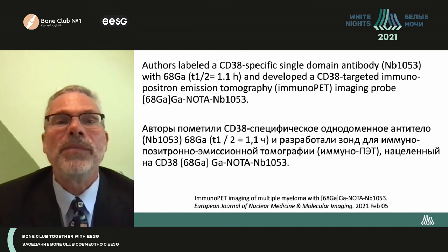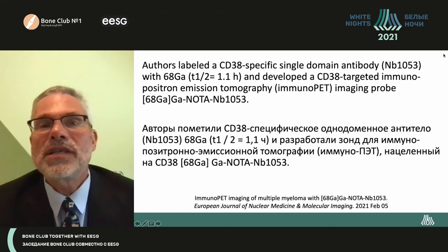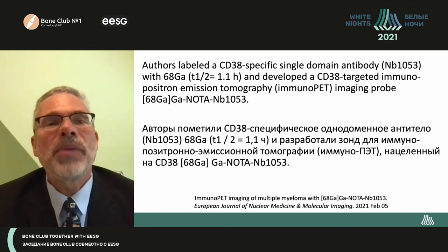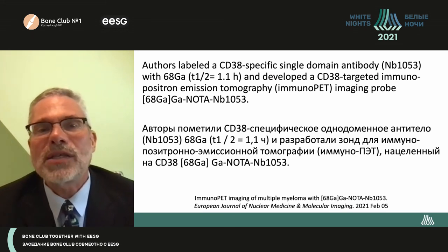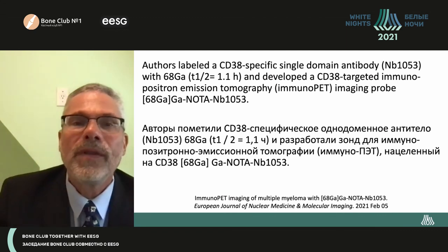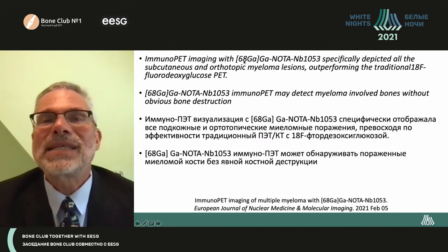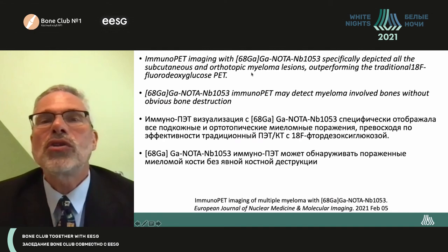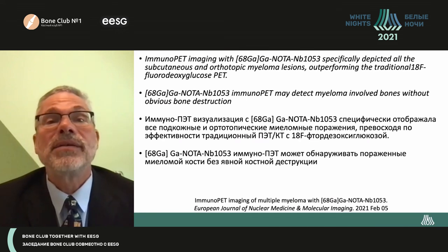Now, there's another study that recently was published, which I'm putting forward to you as a cutting edge type of where we're going. The authors labeled a CD38 specific single domain antibody with gallium-68, and they developed a CD38 targeted immunopositron emission tomography imaging probe. And what they found was that immunoPET imaging with this gallium-68 CD38 probe depicted all subcutaneous and orthotopic myeloma lesions, outperforming the traditional FDG PET.